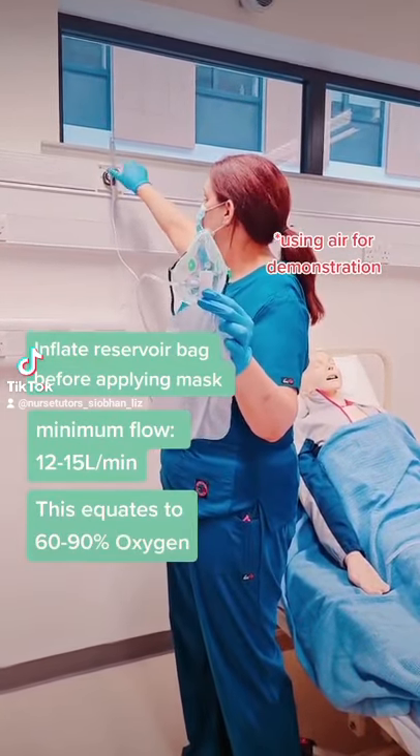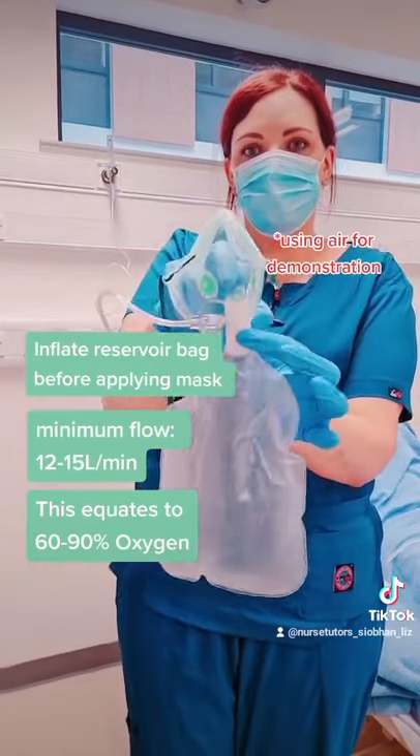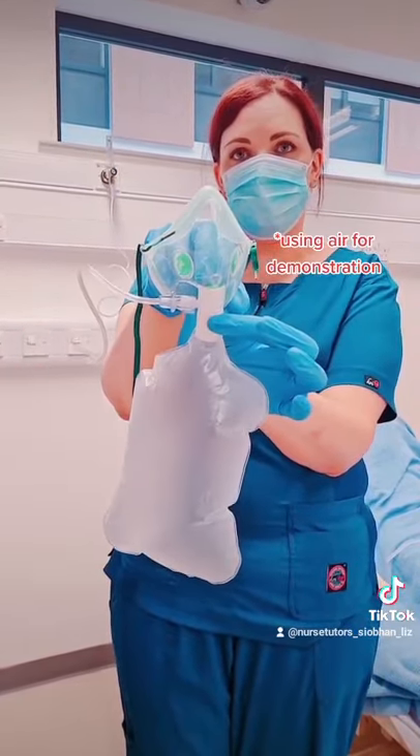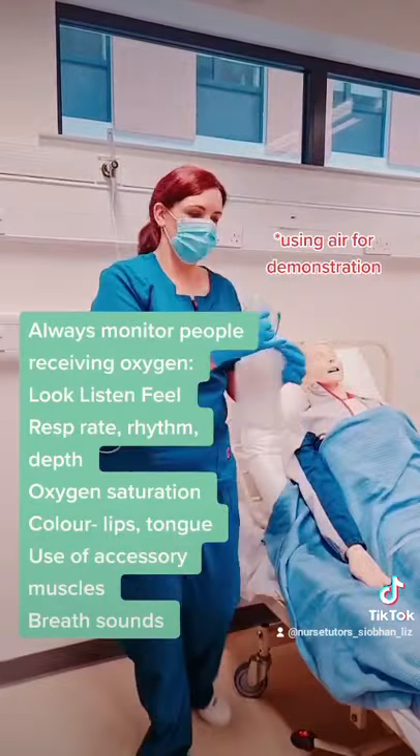To fill the reservoir bag, always turn it up to 15 litres, cover the valve, and allow the reservoir bag to fill. Once filled, you can then attach it to the patient.